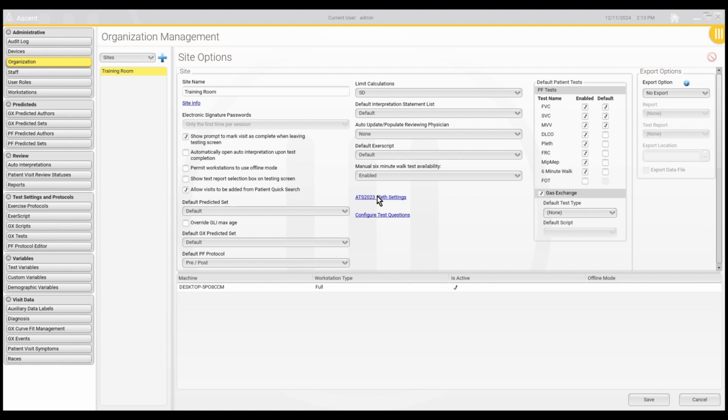We also have a pant thermal drift limit. The thermal drift occurs when successive closed loop pants move in the same direction, measured from the y-axis. The limit between acceptable and usable defaults to 2, and the limit between usable and unacceptable defaults to 3. And finally, we have the end tidal drift limit. End tidal drift occurs when successive end expiratory peaks move in the same direction and is only measured when breath stability is greater than 15%. Sorry. Unstable end tidal lung volumes are usable in the absence of significant drift in either direction.